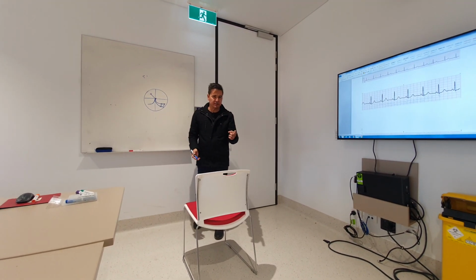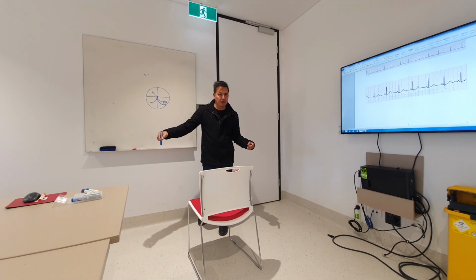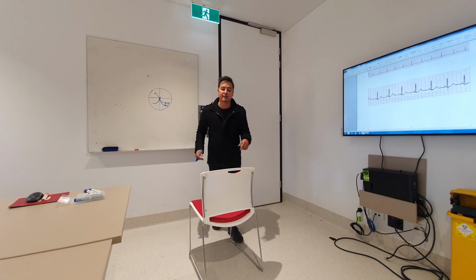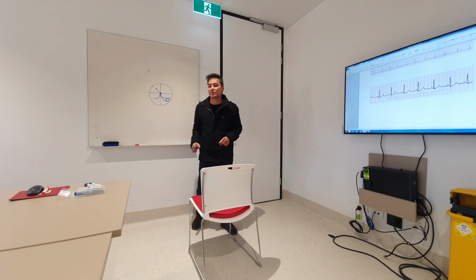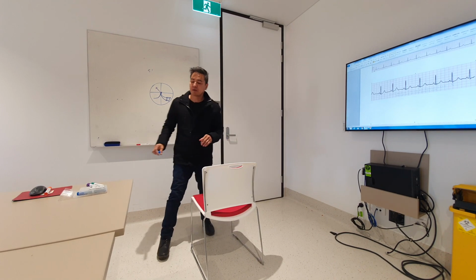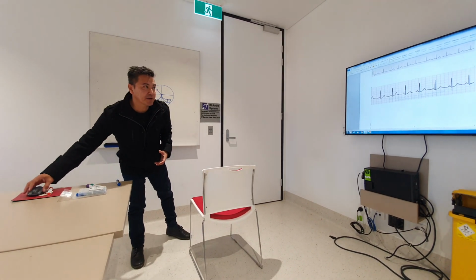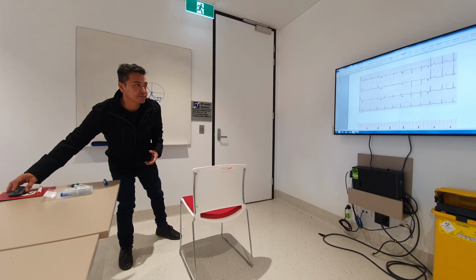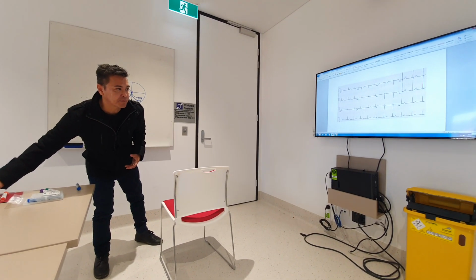So it makes sense that if I'm looking at one particular lead at the same thing, it's going to look different. In fact, one of the leads does this. It's looking at it upside down. I'll talk about that lead later, all right? So the leads mean something. So if I take you back to this 12-lead ECG, and I'll even make the picture a little bit bigger.